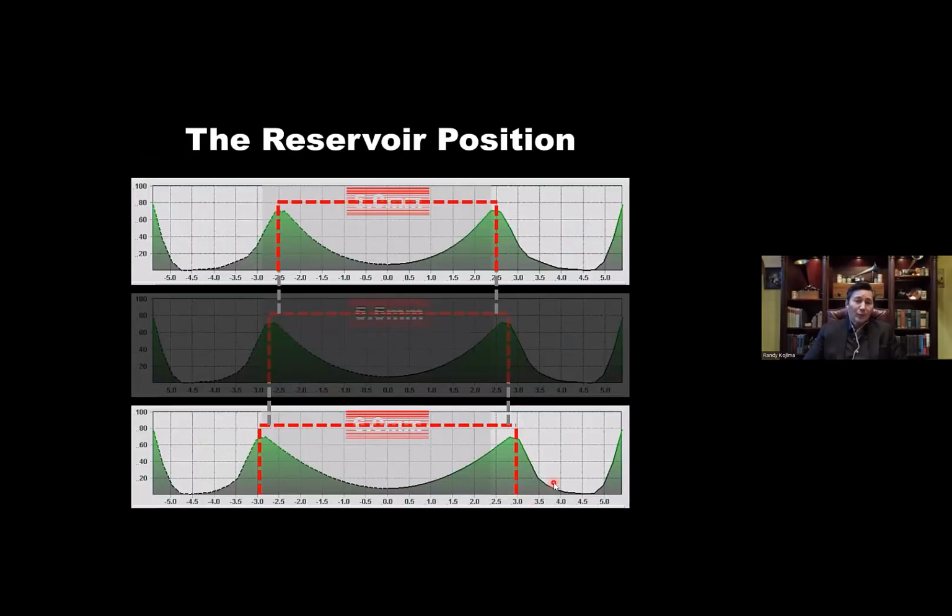And essentially what we're doing is comparing a conventional 6 mm optic zone. This is the size of OZ that most orthokeratology lenses have today. They were designed well before the millennium. The idea being if you had a large 6 mm optic zone, you create a larger treatment zone, and therefore the patients will have good quality of vision. The patients at the time that we were fitting before the millennium were adults. It wasn't for myopia control.